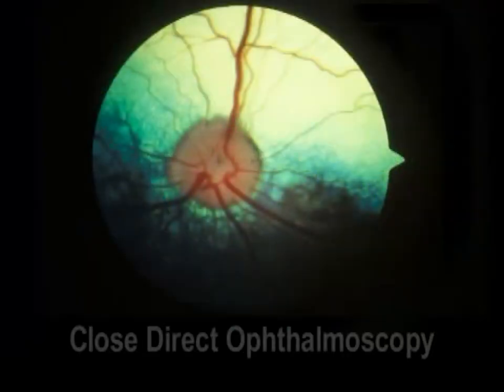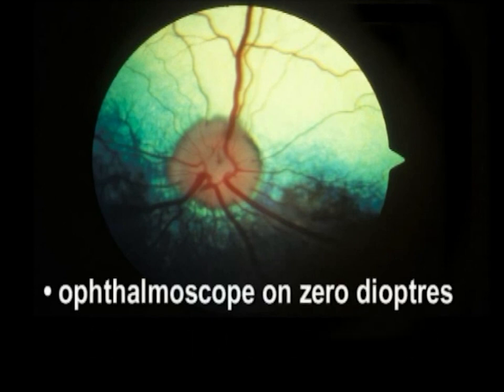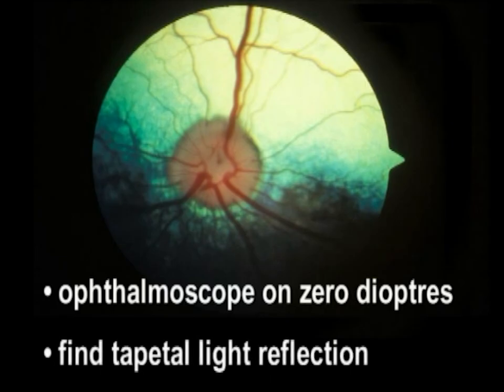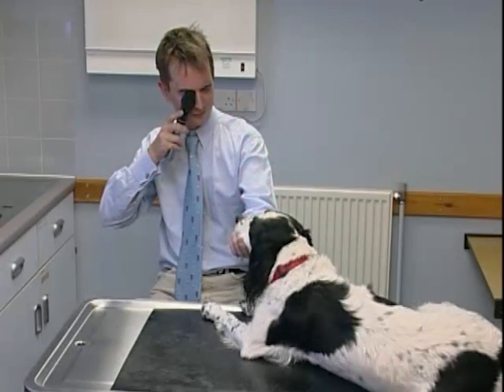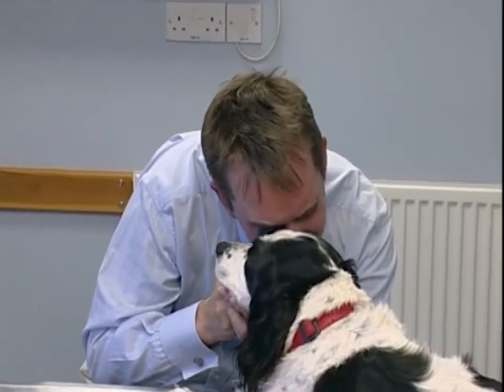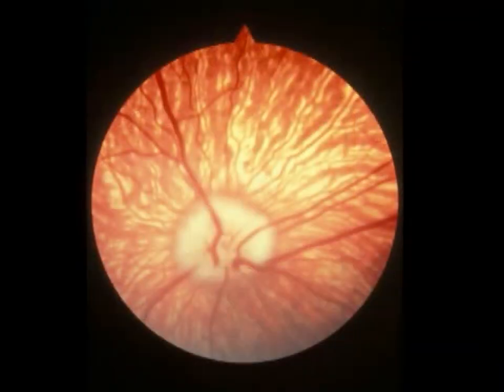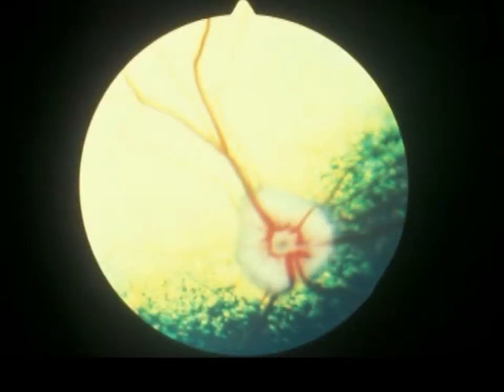Close direct ophthalmoscopy is the other procedure that can be performed with the ophthalmoscope. In this technique, the observer sets the ophthalmoscope on 0 diopters and finds the tapetal light reflection. The observer then moves towards the patient until they are finally only a maximum of a couple of centimetres away from the corneal surface. At this point, the retina should be in focus. It may be necessary to alter the diopter setting in order to get the optic nerve head in focus.